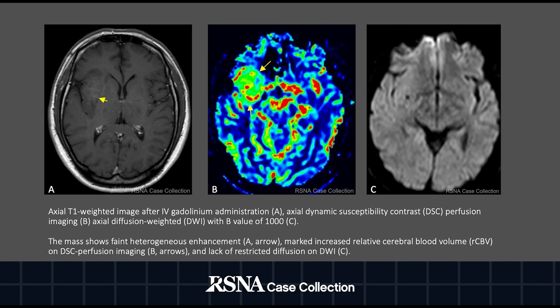On the T1 post-contrast sequence, the image to your far left shows faint linear enhancement within the mass. MR perfusion, the middle image, shows increased areas of high cerebral blood volume. The image to your far right is a DWI map, where we can see a mismatch between MR perfusion and DWI — the areas of high perfusion within the mass do not show restricted diffusion.